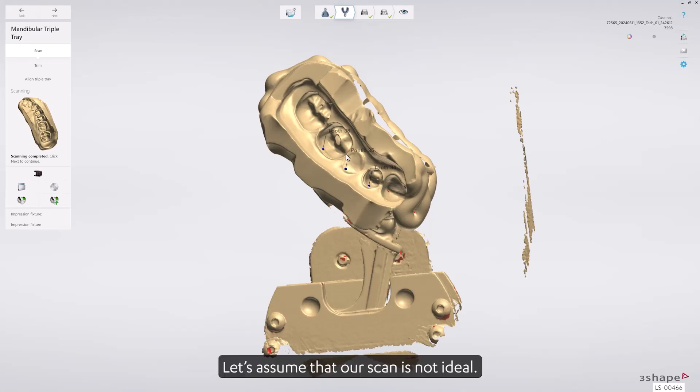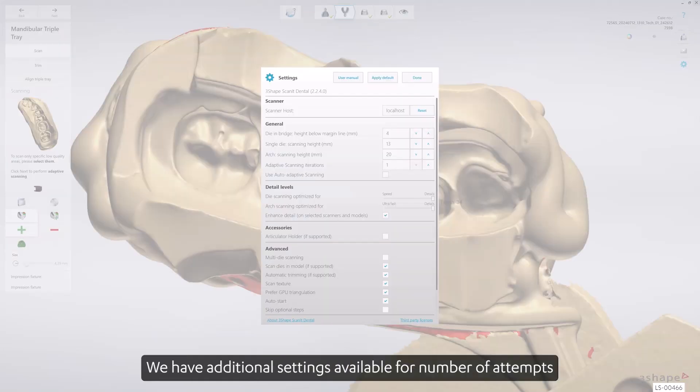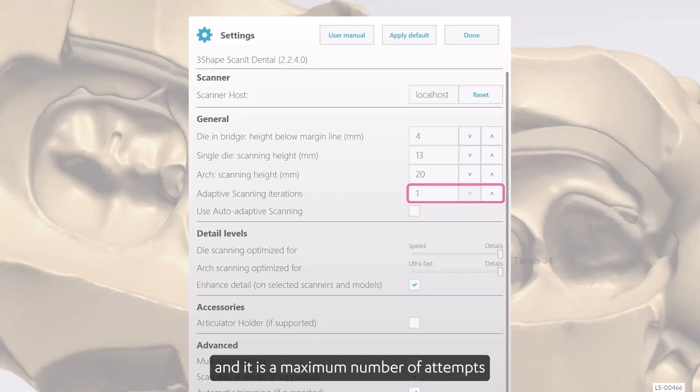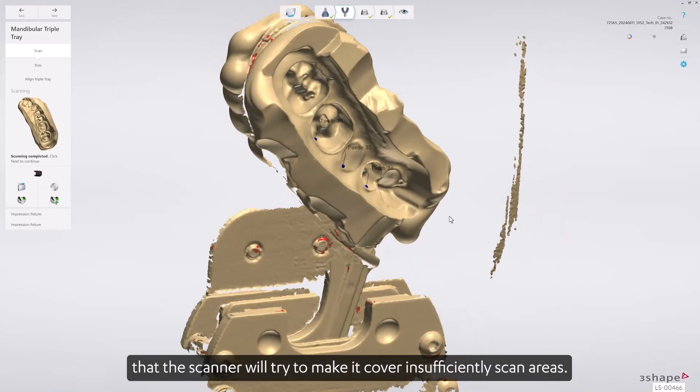Let's assume that our scan is not ideal. Then we could try to use the additional scan feature. We have additional settings available for the number of attempts to make full surface coverage — it is the maximum number of attempts that the scanner will try to cover insufficiently scanned areas.